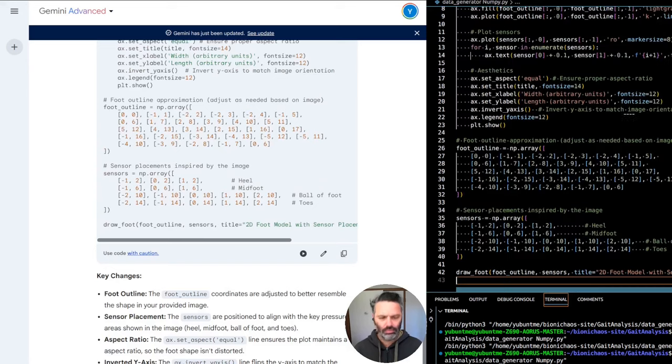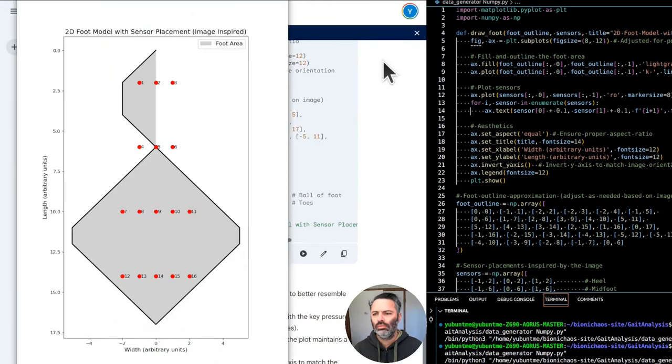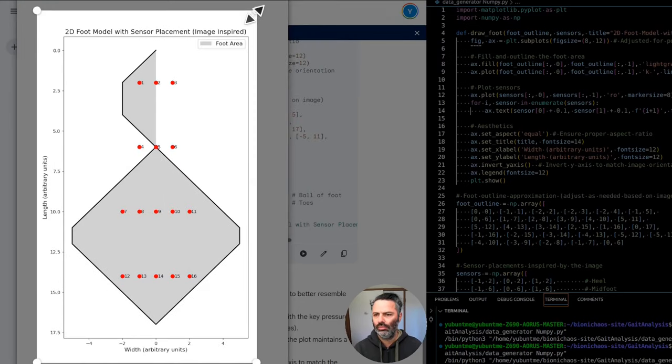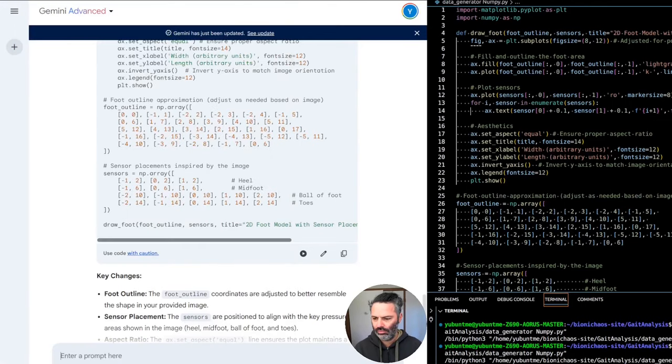Key changes. Foot outline: the foot_outline coordinates are adjusted to better resemble the shape in your provided image. Sensor placement: the sensors are positioned to align with the key pressure areas shown in the image. Heel, midfoot, ball of foot, and toes. Aspect ratio: the ax.set_aspect('equal') line ensures the plot maintains a 1-to-1 aspect ratio, so the foot shape isn't distorted. Inverted y-axis: the ax.invert_yaxis() line flips the y-axis to match the orientation of your image, where the toes are at the top.